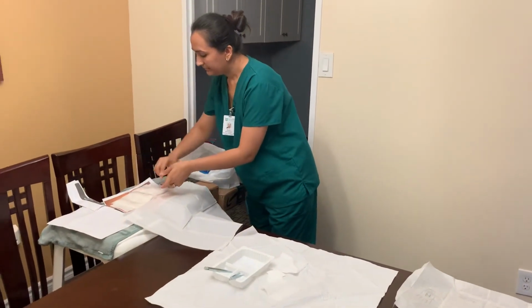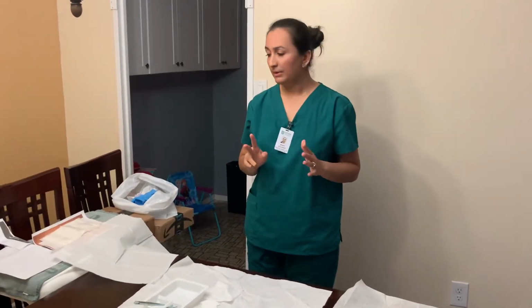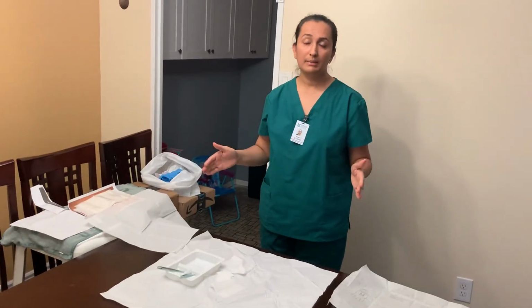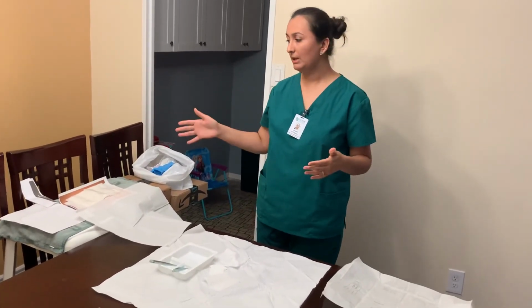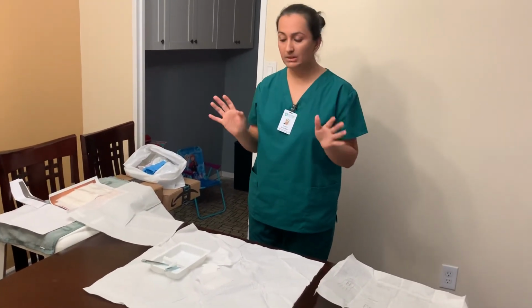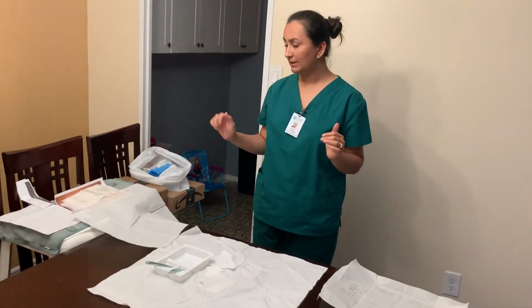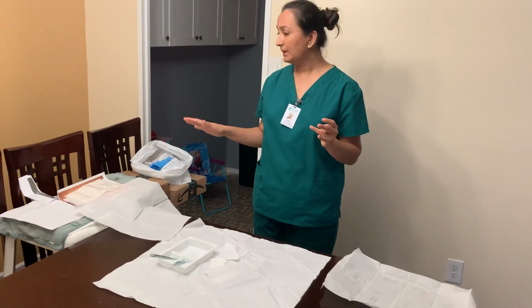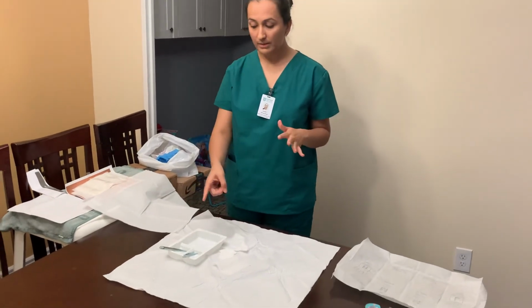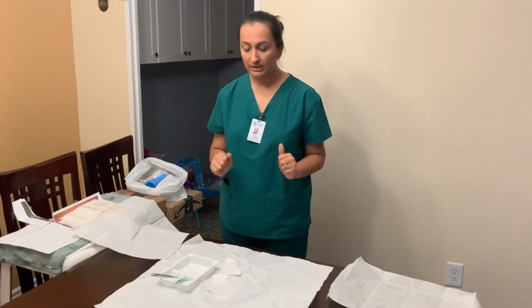Okay, so now I forgot to mention two things here. When we started our table, the side table has to be about waist level. Same thing for the bed, it has to be about waist level, and hence all the time above the sterile field, so that it's not contaminated. Now we are done with the dressing. The dressing is secured properly. Now I'm just going to dispose of this in the biohazard, and this metal forceps goes in the sharps container, and I'll just clean everything.